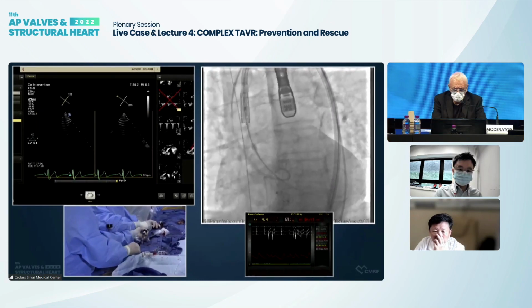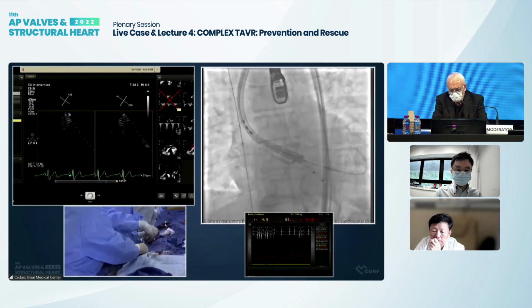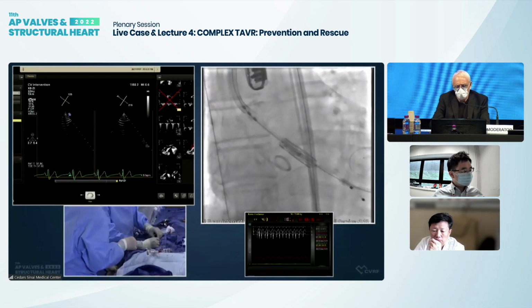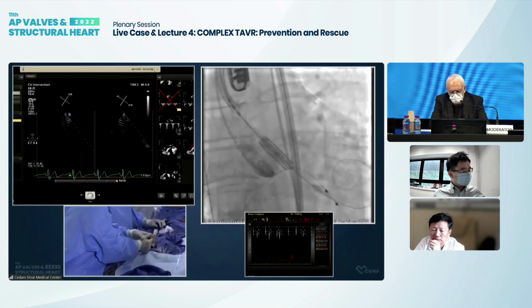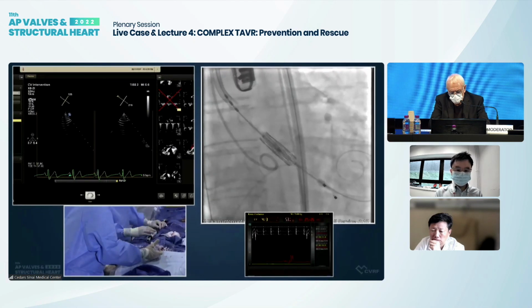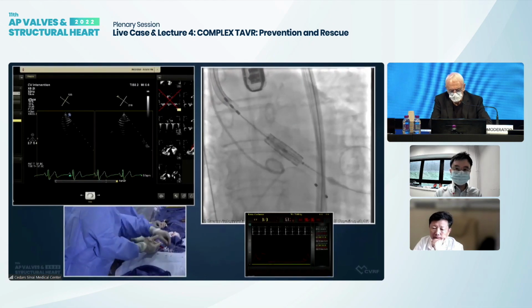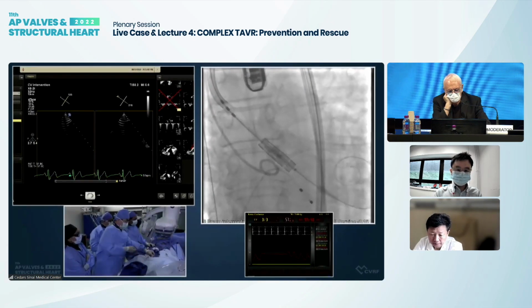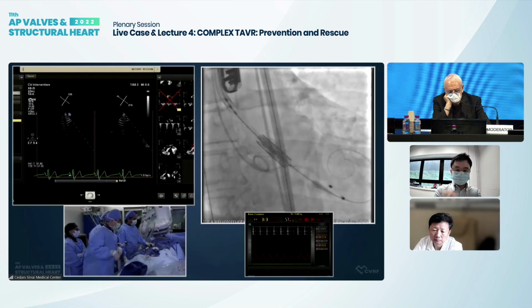Okay, there we go with the valve. All right, so we didn't have to struggle here. So, Raj, before you deploy your philosophy, if I may say, you deploy slowly. Is that correct? Yes, we are not going to unleash the force immediately, but a little bit slowly. Yes, please. And what height are you aiming for? Okay, so I think our angle was, let's take the RAO 13, RAO whatever, 12, 14, and caudal.